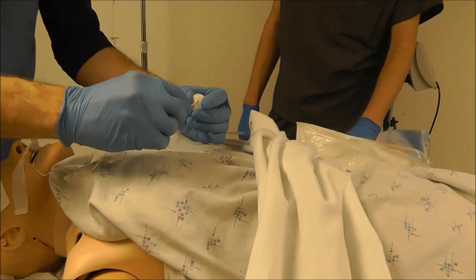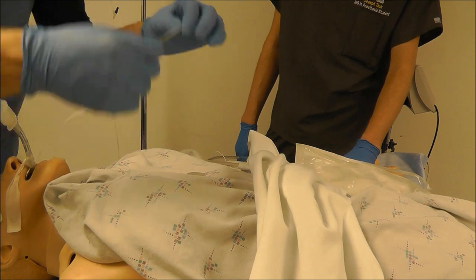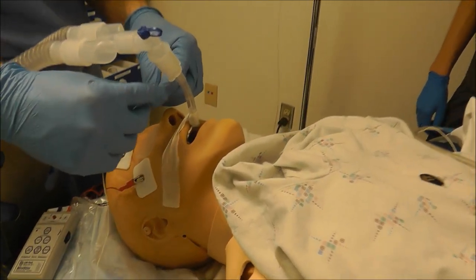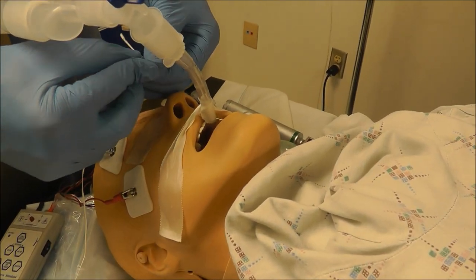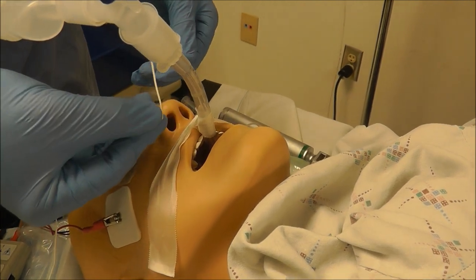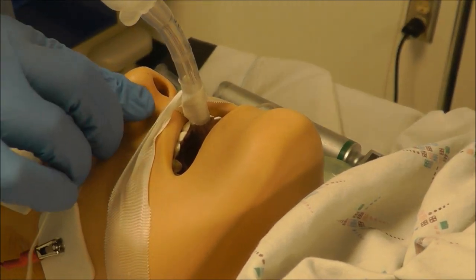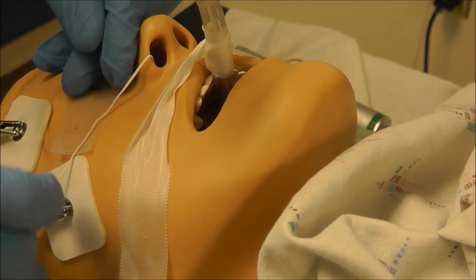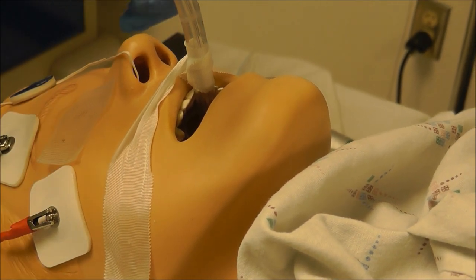We can actually use it as a nasal temperature probe by just disconnecting here and coming over to the nose — kind of make a little 7 or a little L like that — and go ahead and place it in. Then we can use this sticker up here to secure it into place.